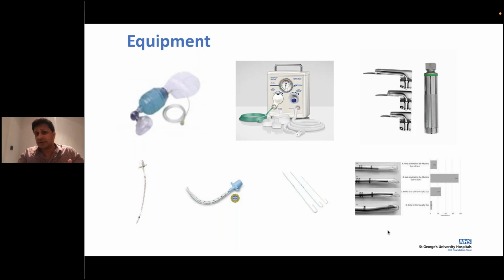Laryngoscope blades come in different sizes. They go from 00, 0, and 1. For the extreme premature baby, you may need to think about 00, and check your batteries beforehand. Quite often it's patient specific. More recently they're all disposable blades, so you don't tend to use the same laryngoscope. Even if you do, it's very likely to be kept for the same patient. It would almost certainly never be used for another patient just by cleaning and moving on.